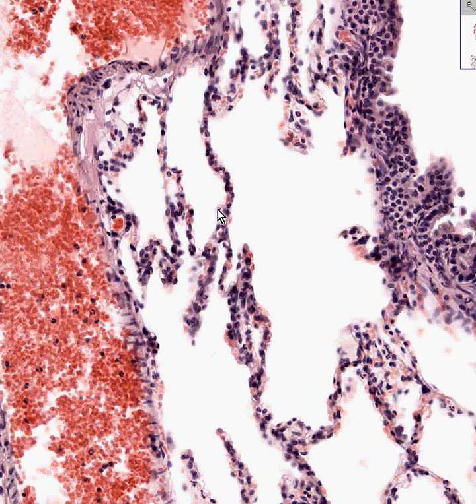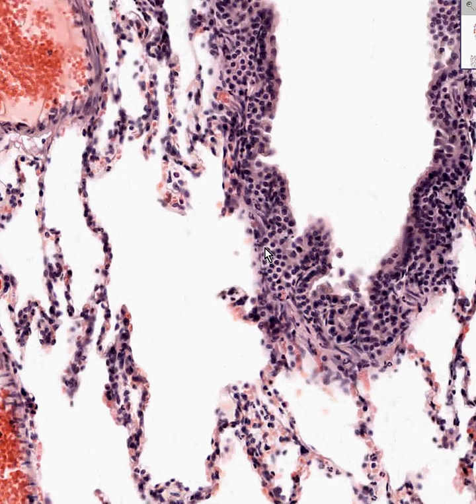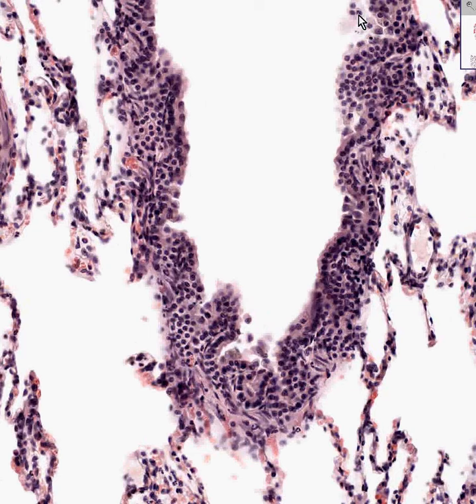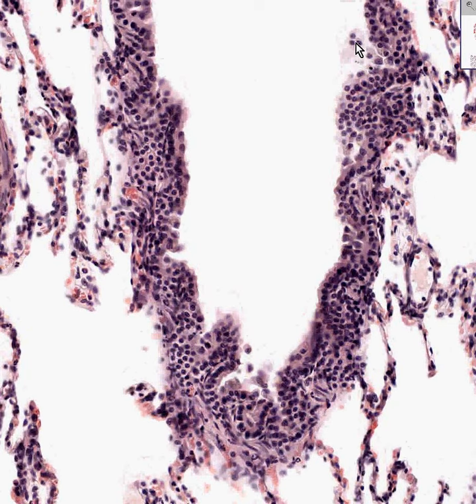If you see a pneumocyte that looks a little bit foamy, like perhaps here, almost looking like a mesothelial cell or a histiocyte, you call those type 2 because those are the ones that have surfactant. In addition, you can see cells like here, which are called Clara cells, which also have surfactant in the bronchioles as well.